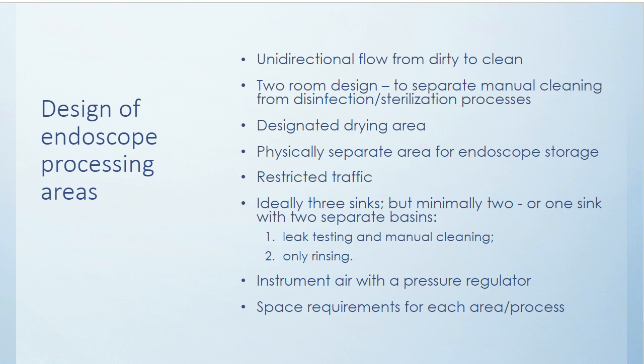The things that we're asking in the standard to do, like cleaning verification tests, we've always asked for cleaning verification tests. There is a lot of data out there to support doing those. The same thing with inspection. Based on the studies that have been done, there's a lot of data to support external inspection, and there's data now to support internal inspection with a borescope. That's why all of that is in this new standard.